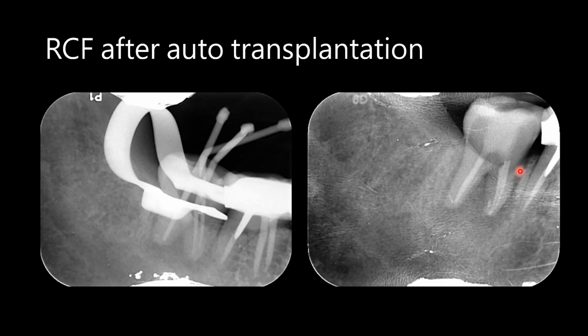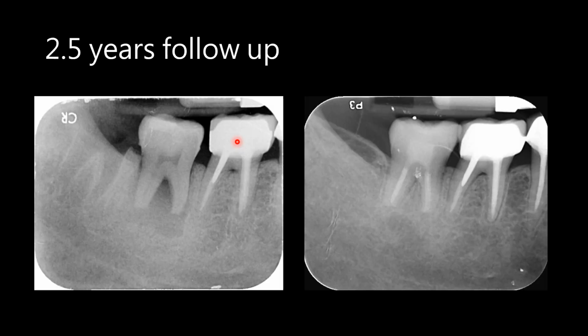And after that, we perform the root canal treatment after the auto transplantation. I have this patient. You can see, of course, the third molar extraction is here, and the lesion and the cavity I prepared is here. This one is a 2.5-year follow-up.